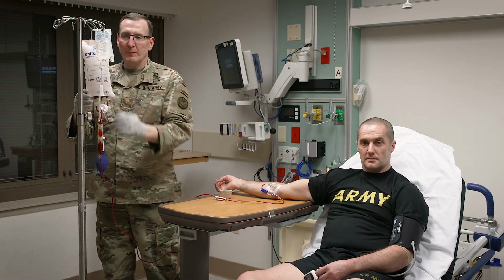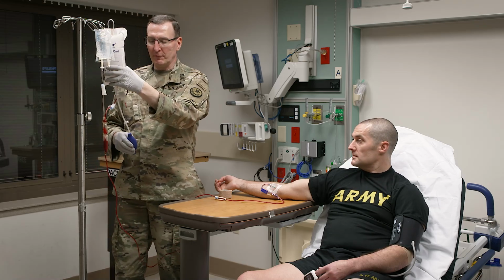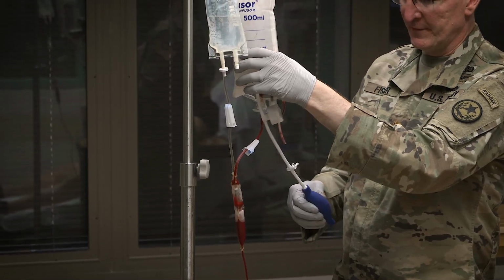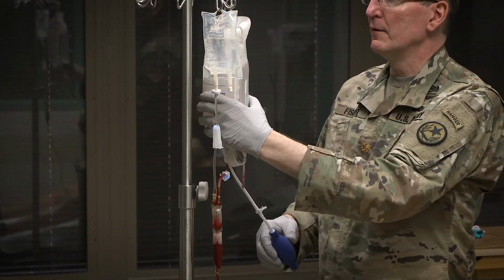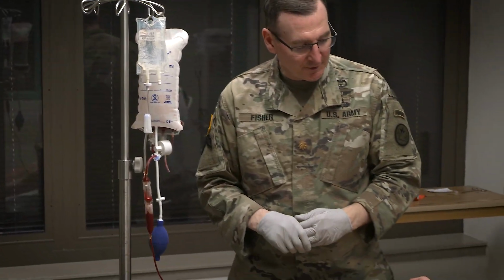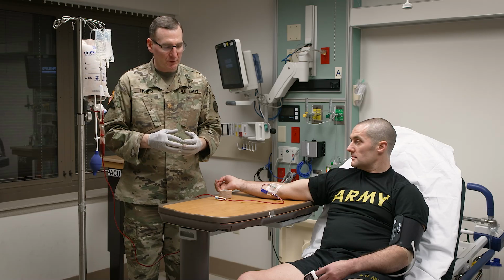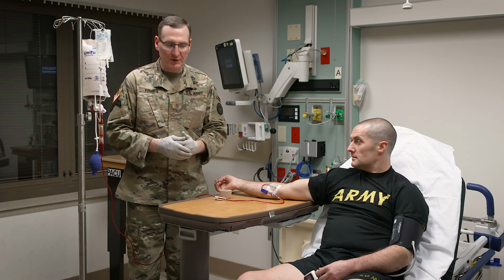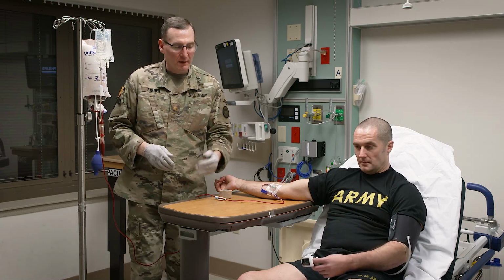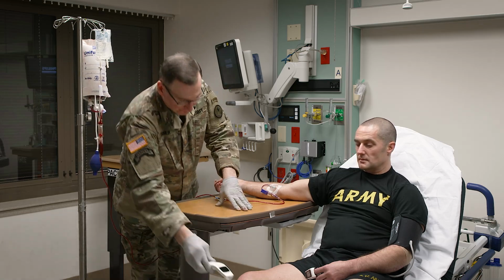So I'm going to make sure I still have my saline here hooked up, still have plenty in there that I can go ahead and run through the line here. I'm going to go ahead and get another set of vital signs to make sure that we're following appropriate protocols to make sure my patient is safe and not having an adverse event. Again, that can consist of a blood pressure, SpO2, heart rate, and a temperature.